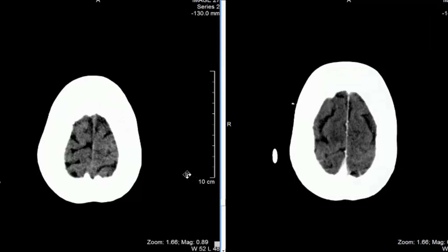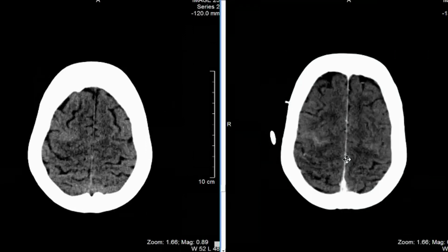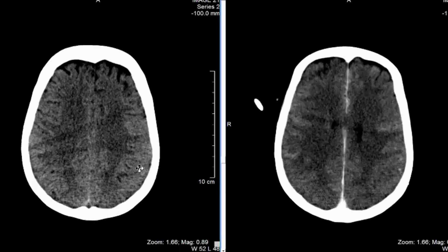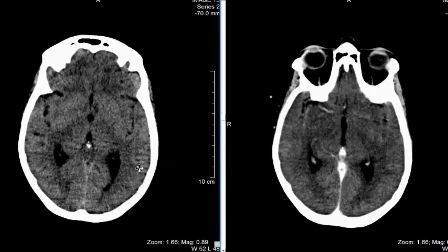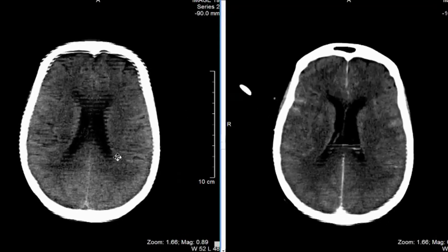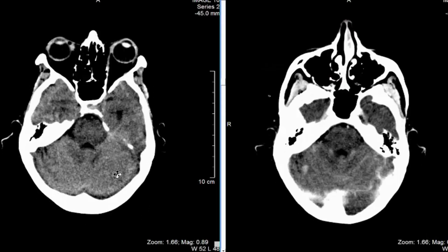In this case, the history provided was altered mental status with a history of breast cancer. On the left I have a non-contrast head CT and on the right is a post-contrast head CT. As we scroll down, the non-contrast really looks pretty normal — we're not seeing much of anything. All the sulci are pretty much symmetric and ventricles don't look enlarged, so we don't have much to go on from the non-contrast study.